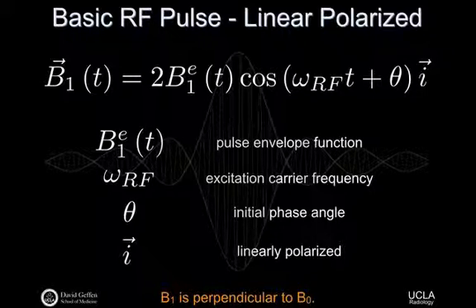What's probably a little bit more expected or understood is that we also have to drive, we're going to generate a B1 field that oscillates, choose a function of cosine, according to the radio frequency that we need, right? The Larmor frequency in principle. And then in fact, we could change the phase on this thing if we wanted to as well. And we'll talk a fair bit about the phase today as well. So there's an envelope function. There's a so-called carrier frequency.